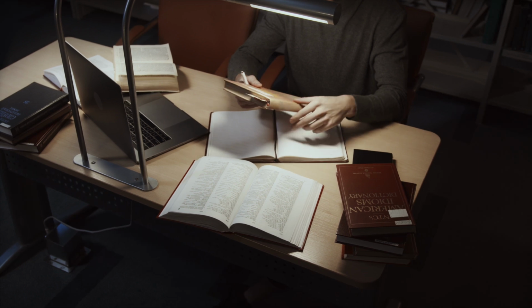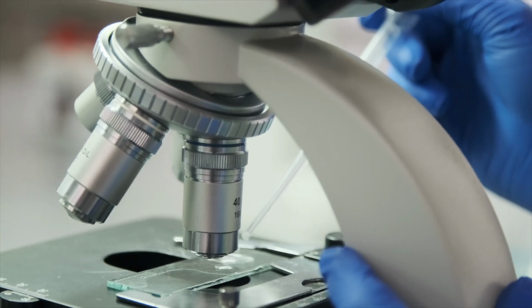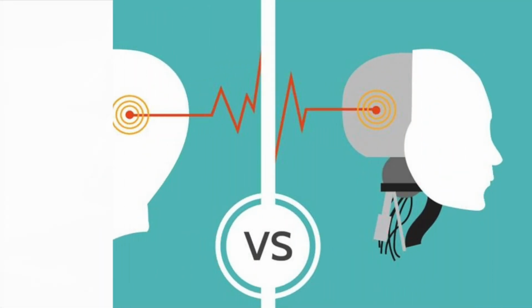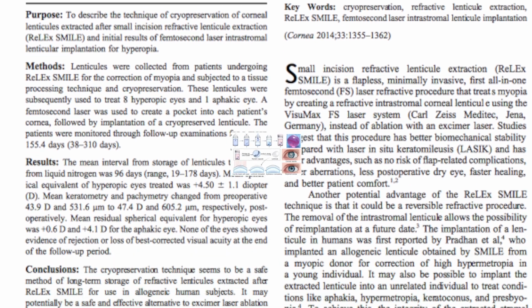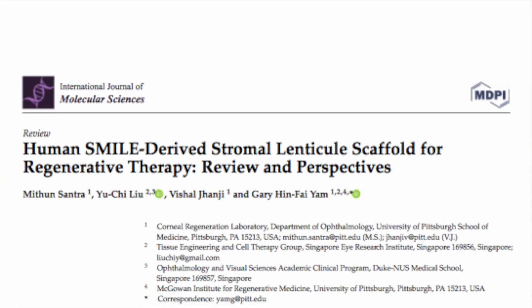Once we have understood the dynamics of the procedure, it brings us to our next question, which is, why is this lenticule so important? Over time, we have realized what the true potential of human tissue is. An artificially made clone of the human tissue will never be able to replicate what we can achieve by using an original human tissue. Way back in 2014, we started cryopreserving the SMILE lenticule for possible potential use in human subjects. And less than half a decade later, we started using it in construction of corneal stroma, therapeutic keratoplasty, keratoconus, and most recently in regenerative therapy.